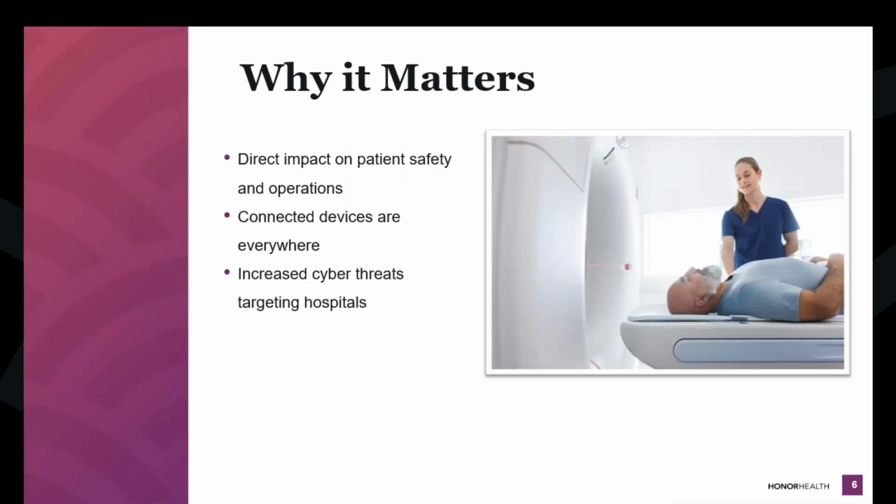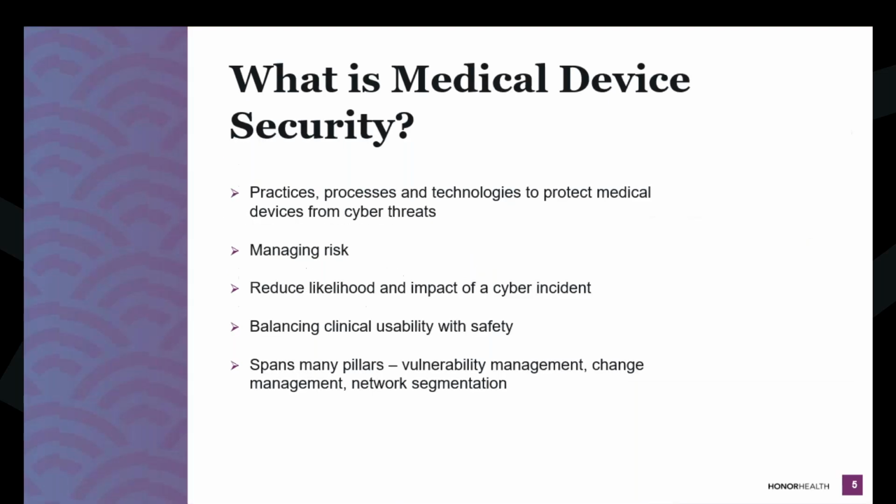Just to add to that real quick, Jessica brought this point up: you have a patient who has had a stroke or is a STEMI or something. Do you want to have a 27 character password to get into that device when seconds matter? That's where we try to balance what is going to keep most people out but allow our clinicians to do their job too.